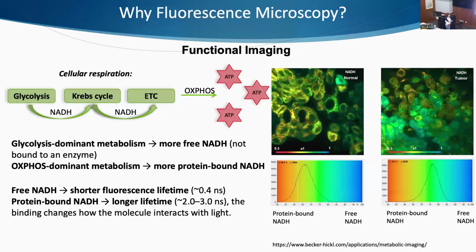And this is an example that shows this fluorescence lifetime shifting towards free NADH and shorter fluorescence lifetime in tumors versus normal cells. It's a very useful way.